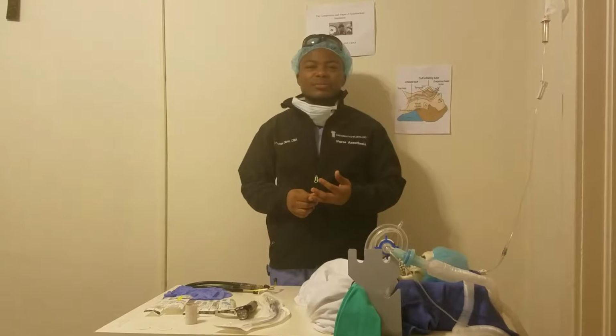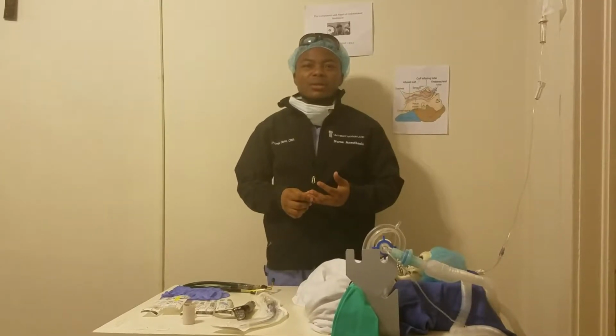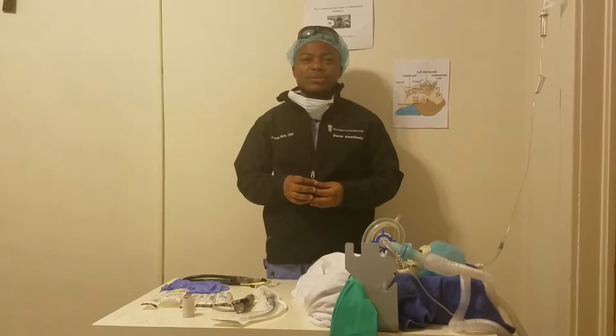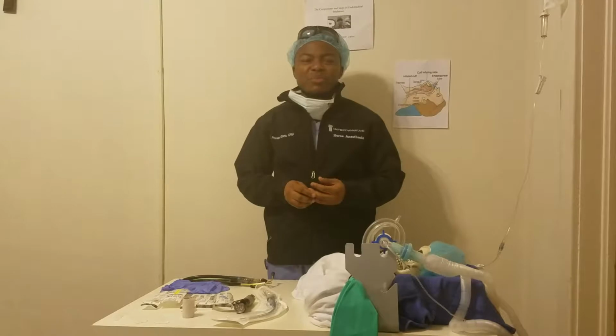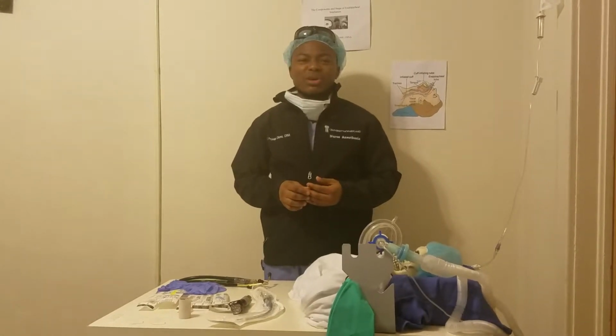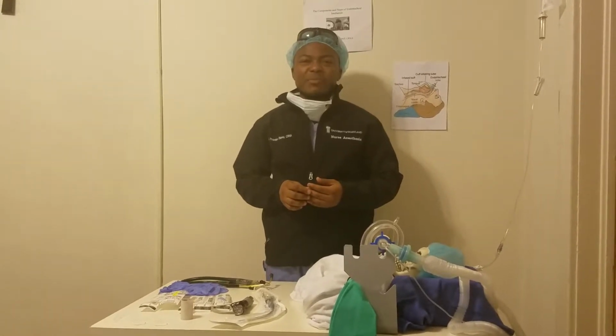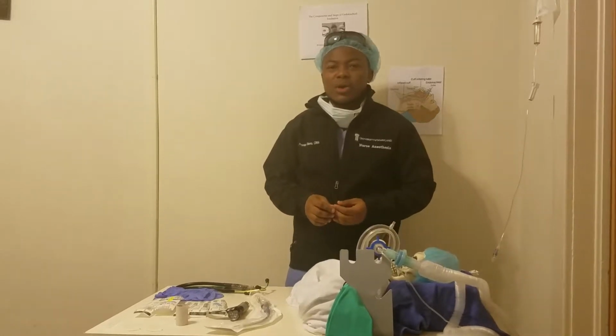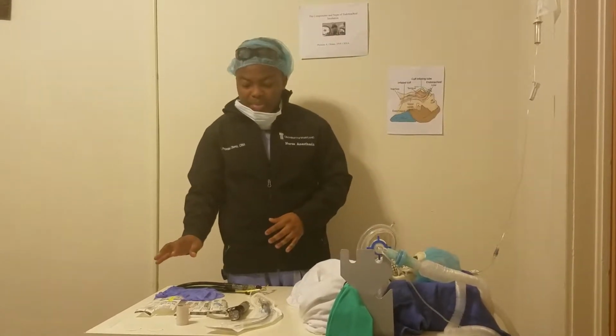We begin. The components of endotracheal intubation are preparation, positioning, pre-oxygenation, intubation, and confirmation of intubation. I repeat again: preparation, positioning of the patient, pre-oxygenation of the patient, intubation of the patient, and confirmation of the endotracheal tube. First, in preparation, all the equipment we need is what we prepare with.